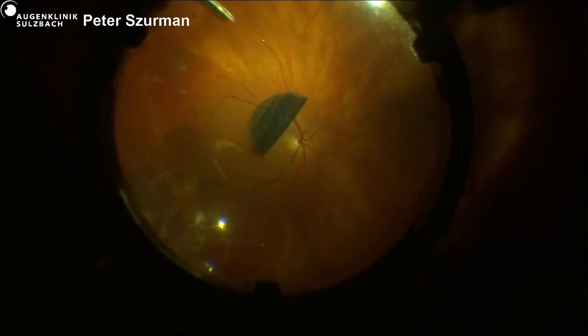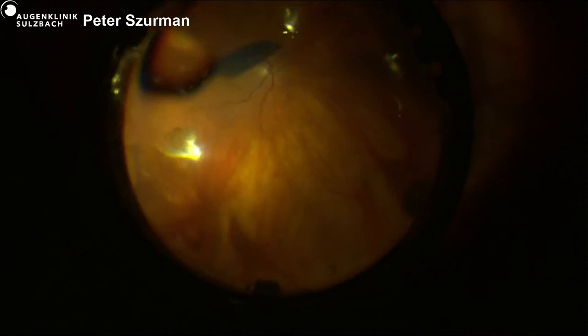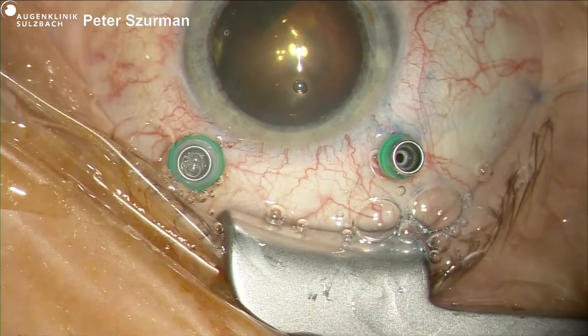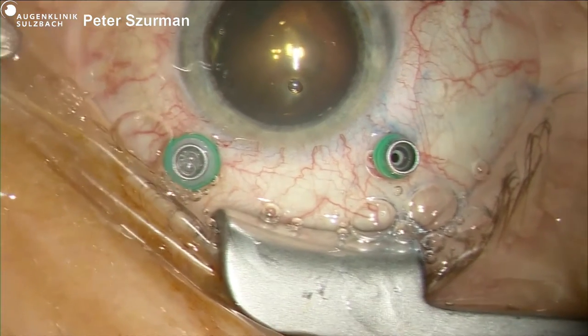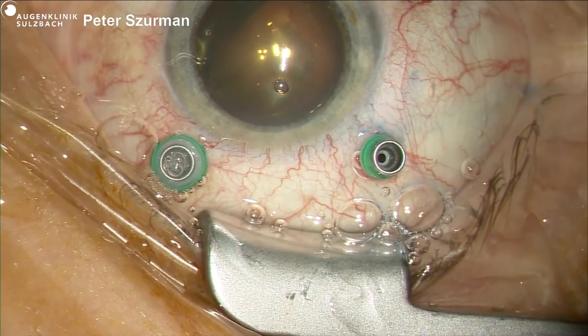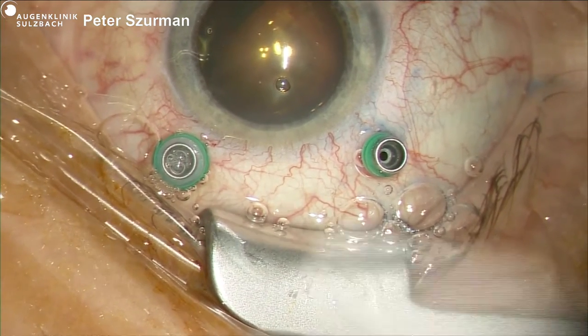Okay, so here is the patch. And we will close the valve. Second one. And I get the trocar holder. Okay, yes.